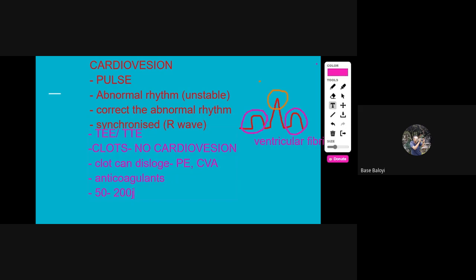And remember, back to your cardioversion, when we cardiovert, we use what we call synchronized cardioversion, meaning that you are synchronizing the cardioversion to the R waves. Because if you cardiovert anywhere else and not on the R wave, your patient is going to complicate and go into ventricular fibrillation, which is now much more severe, right? And I know now some of you might be asking, let me just list a few abnormalities for you.